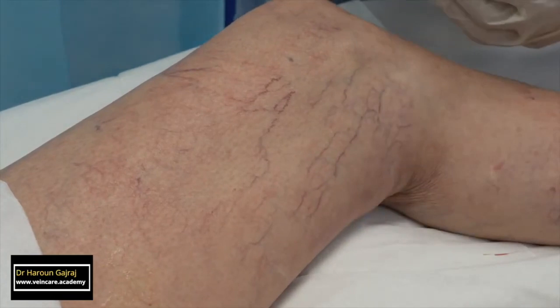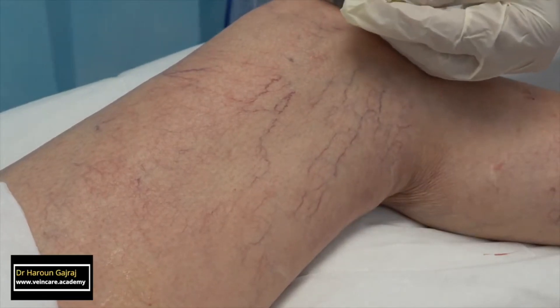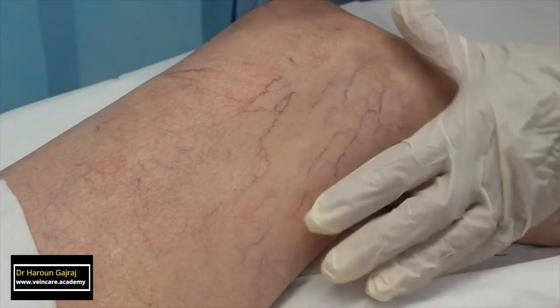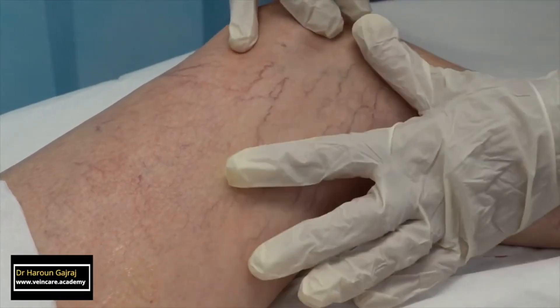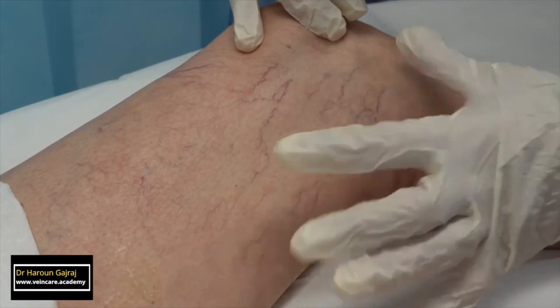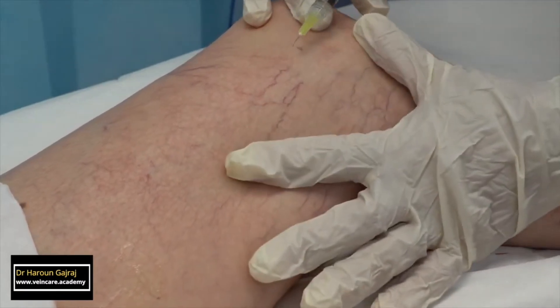Injection of telangiectasias, also called spider veins. Place the skin under tension to provide a flat surface to facilitate needle puncture. This is accomplished by spreading the fingers and thumb of the non-injecting hand and applying counter traction with the little finger and hypothenar eminence of the injecting hand.